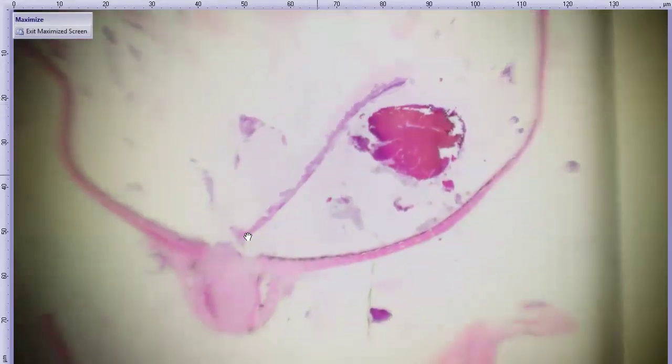I'm going to very briefly show the left eye from a subgross view because it's not the best looking. So cornea up at the top, we've got the intraocular hemorrhage that they noted clinically. The lens was a little bit harder to identify. We can see this bright pink material here, which is lens capsule. It's discontinuous, so there is rupture. And our retina is detached, and again, some hemorrhage here in the subretinal space as well. It's a little bit hard to make out much from the subgross, but I'm going to stick with the right eye, which was a little bit better.